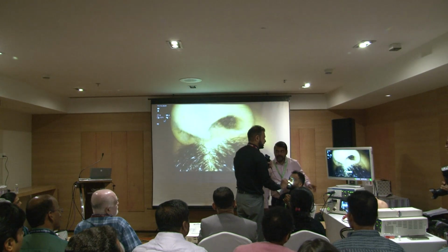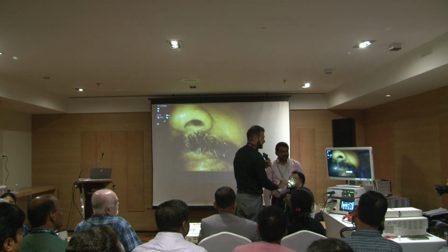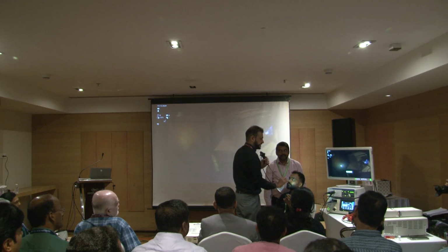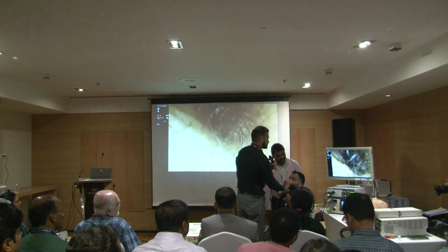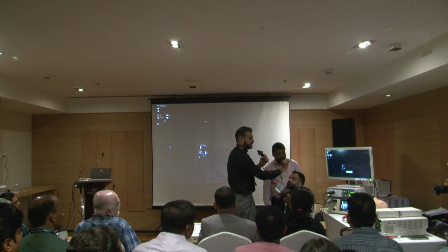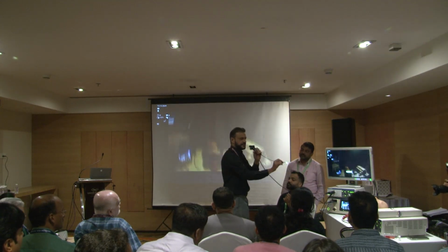We go inside. So we assume I have taken consent of the patient, I have explained to the patient what is to be done, and I have sprayed some lignocaine as I have told you. We go inside the nose. This should be held like a pencil, because the initial problem is crossing the nose, not the oropharynx or the nasopharynx.